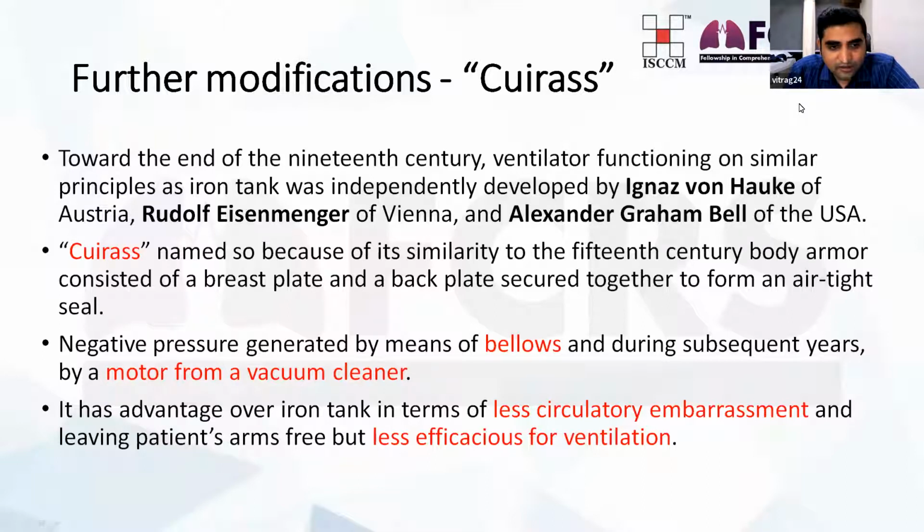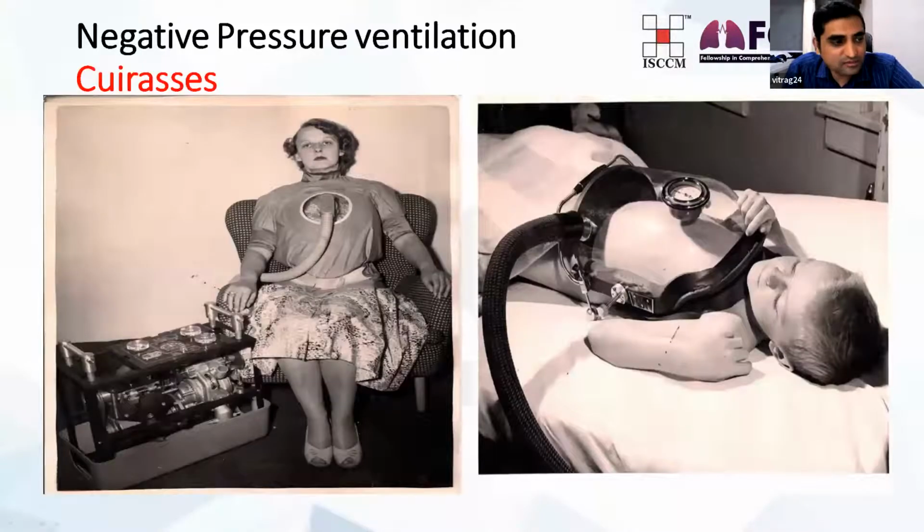It is definitely beneficial over the iron tank in terms of less circulatory embarrassment, but it was not as efficacious as the iron tank for ventilation. So it was also not much used, and further innovation occurred again. So this is the pictorial representation of the cuirass ventilator.